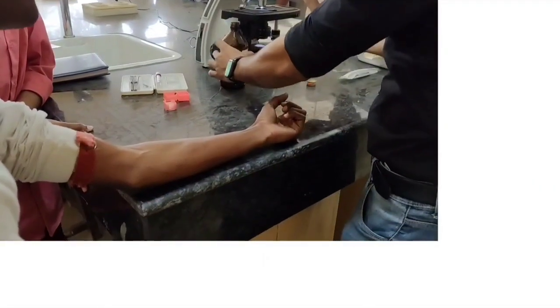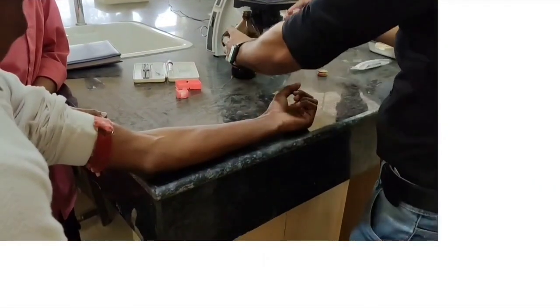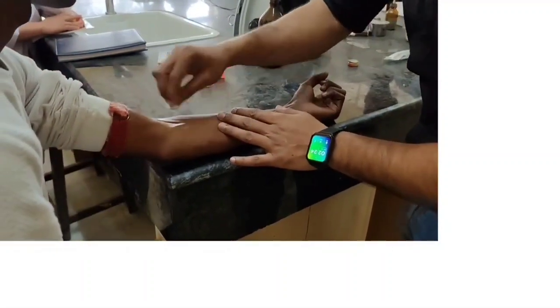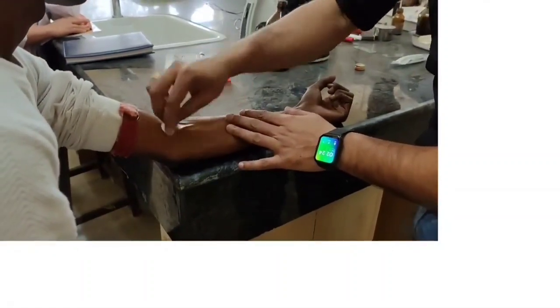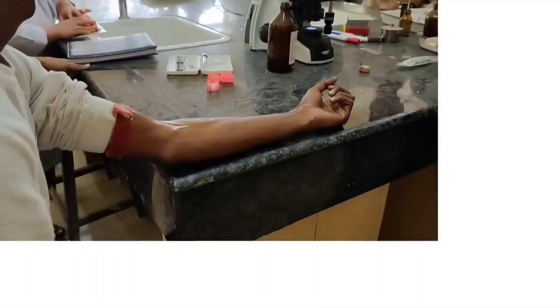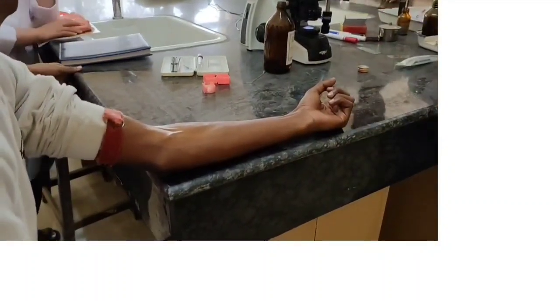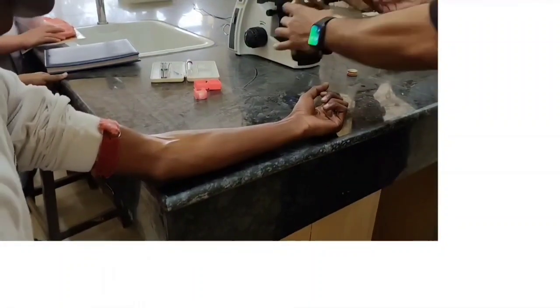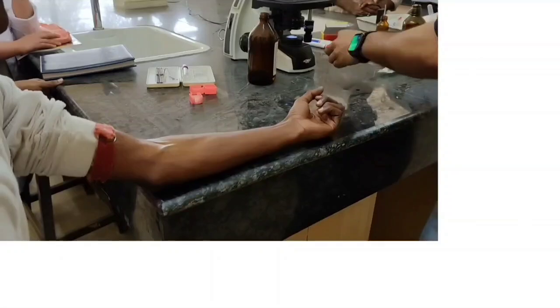Maintaining all the aseptic and antiseptic conditions, we are going to collect blood from a sample, and then we'll count total RBC. We can also prick a finger and take out the blood and do the test, but here we are going to collect the blood in a vial, and then we'll do the test.